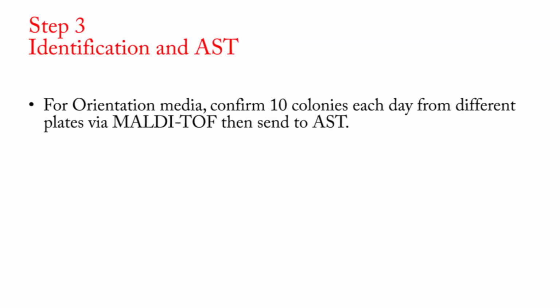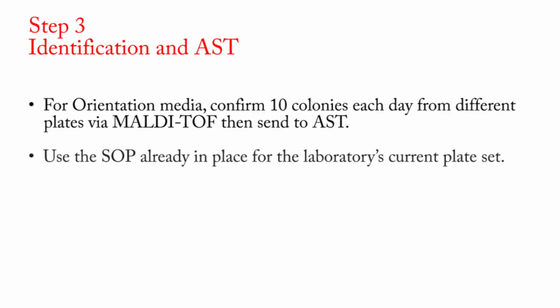Step 3. Identification and AST. For orientation media, confirm 10 colonies each day from different plates via MALDI-TOF, then send to AST. Use the SOP already in place for the laboratory's current plate set.